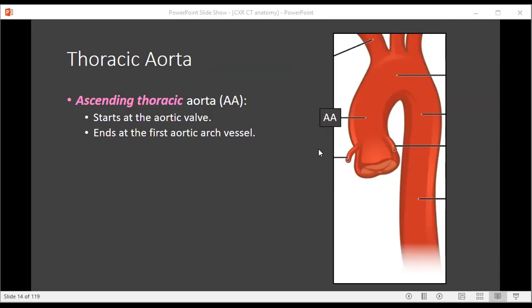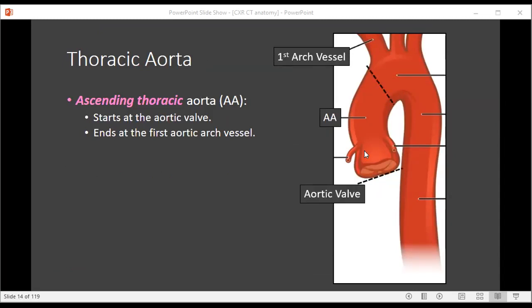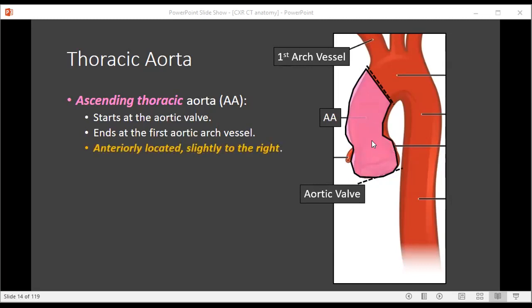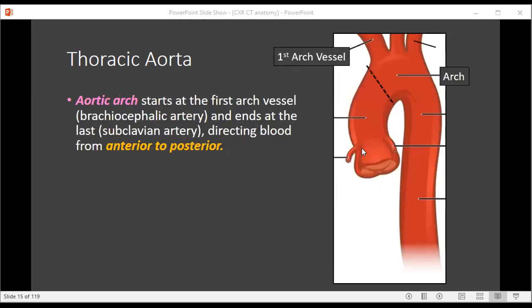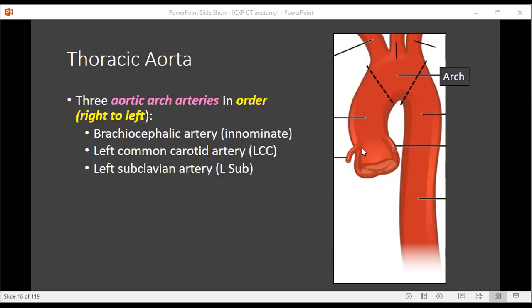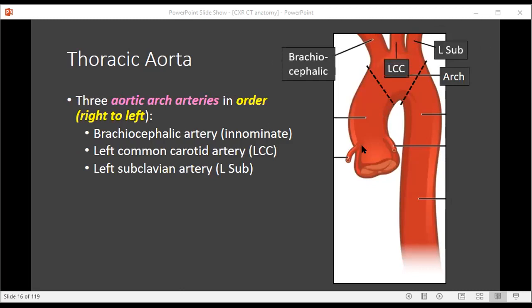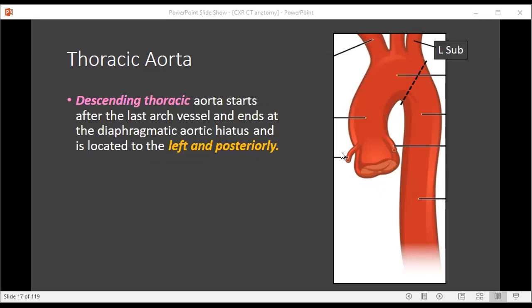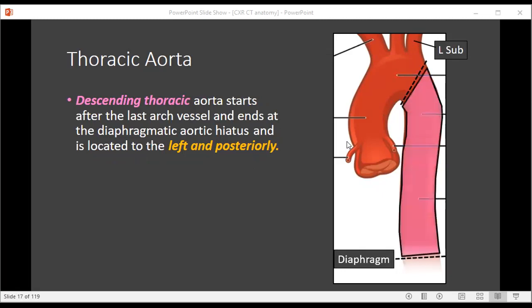The ascending aorta starts at the level of the aortic valve and will end at the level of the first aortic arch artery. It's anteriorly located, or relatively anteriorly located in the mediastinum, and slightly to the right of midline. The aortic arch starts at the first arch vessel and ends at the last arch vessel, with a course that runs from anterior to posterior. The three aortic arch vessels you need to know are the brachiocephalic artery (also known as the innominate artery), the left common carotid, and the left subclavian — you must know this order from right to left. The descending thoracic aorta starts after the last arch vessel, typically the left subclavian artery, and ends at the diaphragmatic hiatus, located to the left of midline and posteriorly adjacent to the spine.